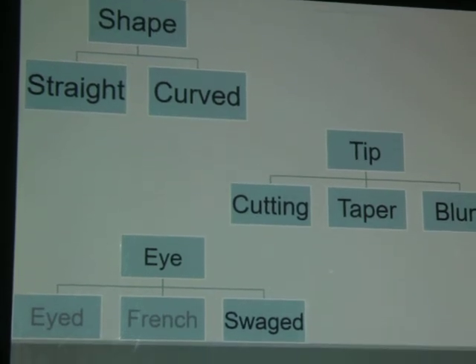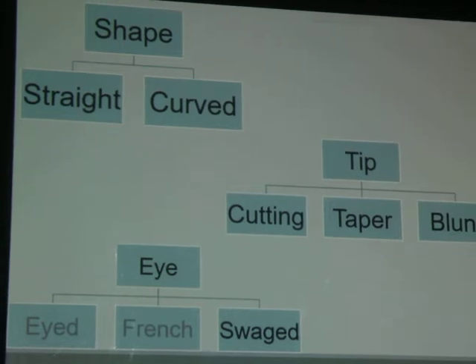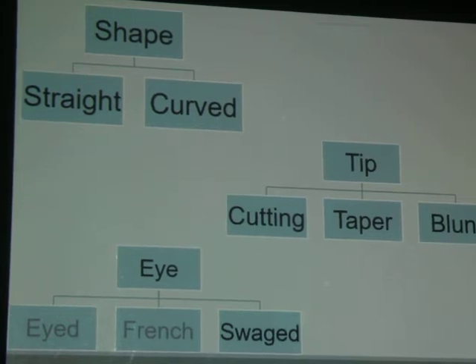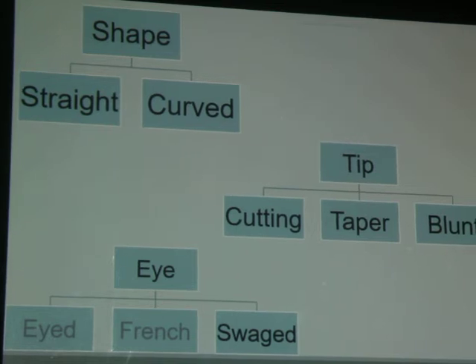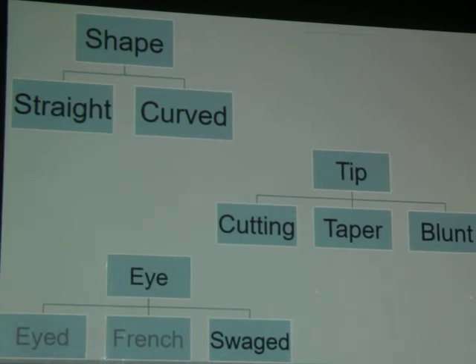So it is much thicker and more damaging to the tissue. وطبعا ظريف جدا وانت بتاخد السوتشر يروح الخيط فالت من الإبرة وتقعد تتربز وتشتم وتزعق. So nowadays there is very limited use of eyed needles and mostly they are pre-mounted. يعني غالبا لو هستعمل needle it is usually pre-mounted with its own suture material.